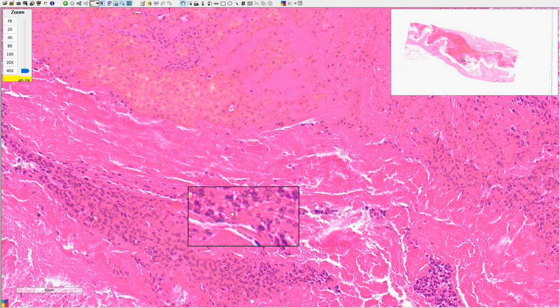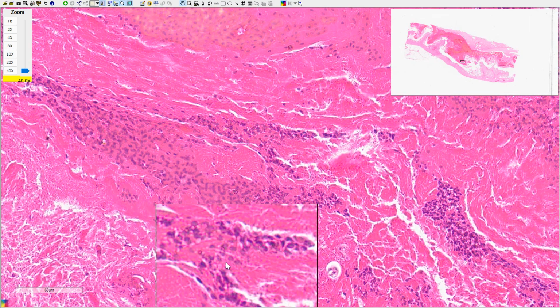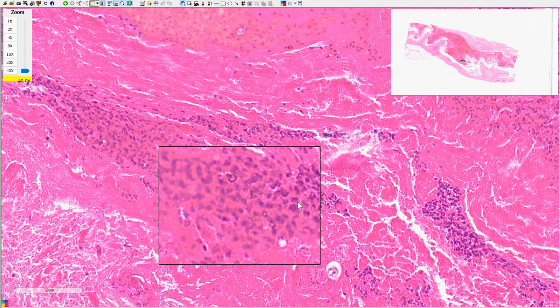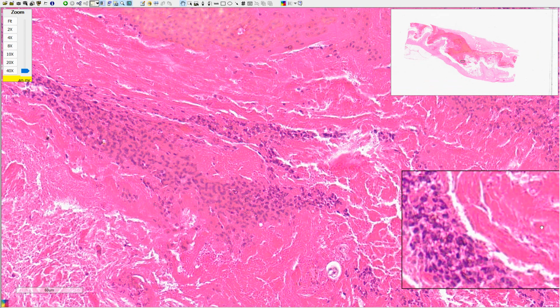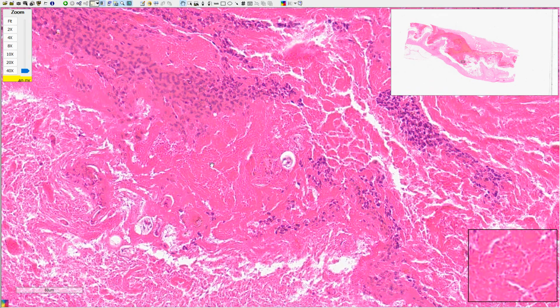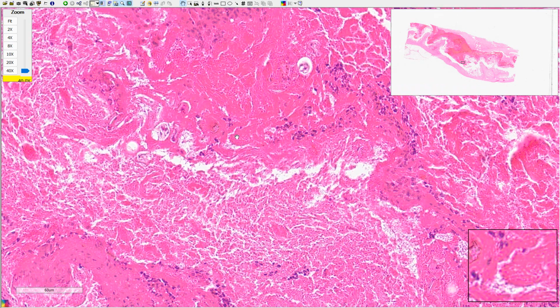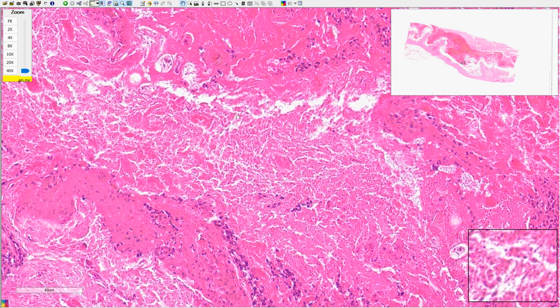If we look with higher magnification, the necrotic tissue is also composed of inflammatory cells, lymphocytes, macrophages, neutrophils, and so on. You can find them here. Because this exudate contains lots of fibrin, this eosinophilic or reddish material here is fibrin, admixed with necrotic tissue, so we call it fibrinonecrotic exudate. So you will find the exudate in the lumen attached to the mucosa.